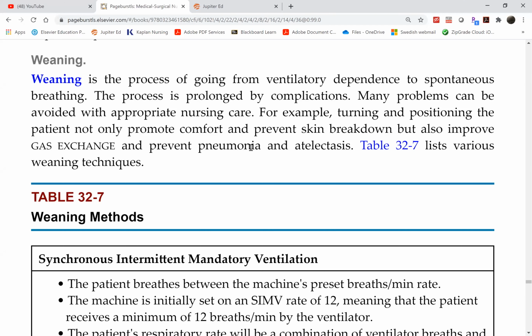Yes, the patient can be sitting up on bed. They can even ambulate. Of course, these are better patients, but unfortunately their lungs are not working well enough. So they can be up out of bed, and you can put them on a chair, but still on a ventilator. All of these patients already have tracheostomies. We just can't wean them yet because their lungs are so weak. But that will help promote the weaning.